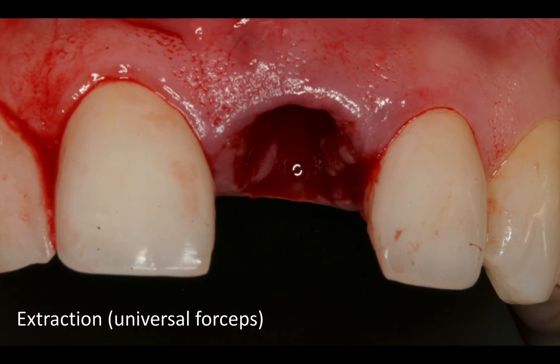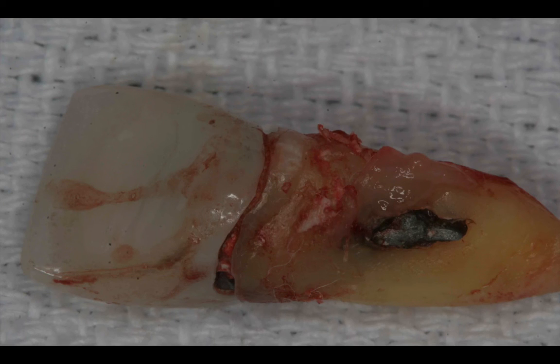So I know this extraction process is simple, which it was. And then once the tooth is out, definitely take a look at it, and you can see the source of this disaster. There's a post-perforation through the root on the mesial aspect, and that caused an infection, leading to the loss of the tooth. But that's history.